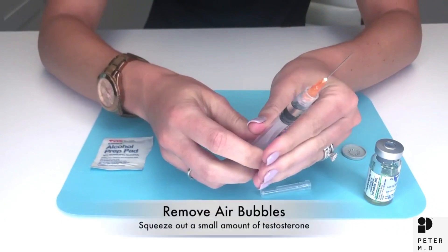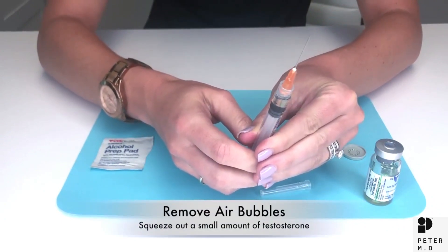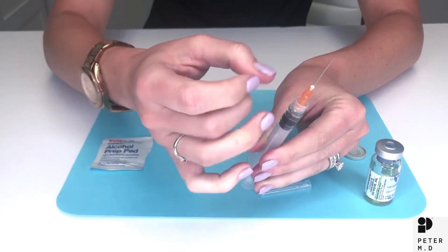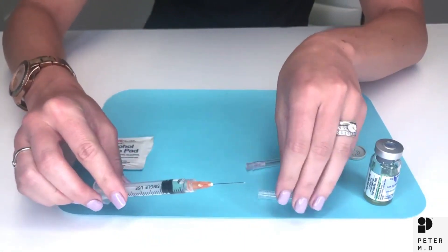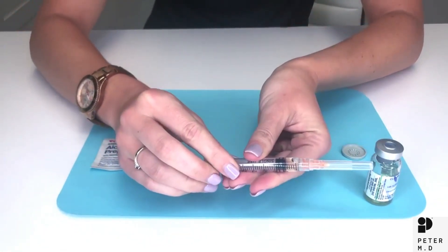Now you're going to squeeze the testosterone up to the top removing any air bubbles. You'll see the bubble come out the top and a little drip that's going to help lubricate the tip of the needle. If there are any extra bubbles you can flick the top of the syringe to remove those. Carefully recap the needle and you are set to do your injection.